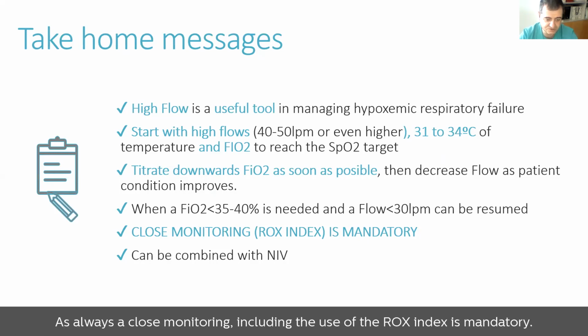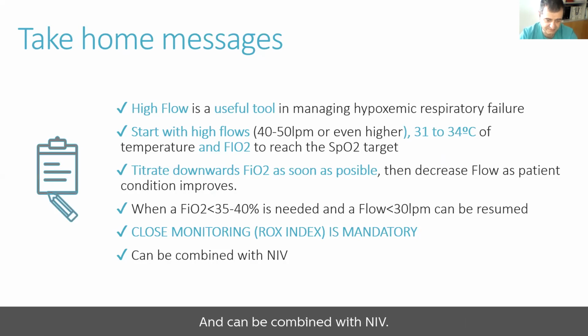As always, close monitoring, including the use of the ROX index, is mandatory and can be combined with NIV.